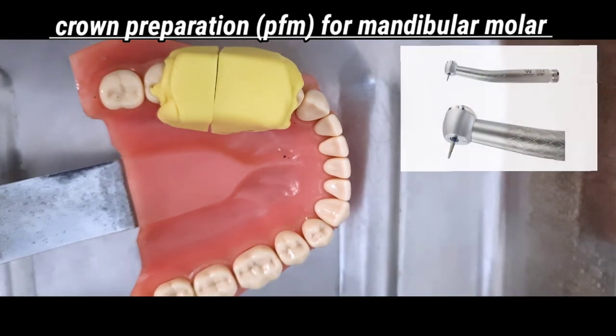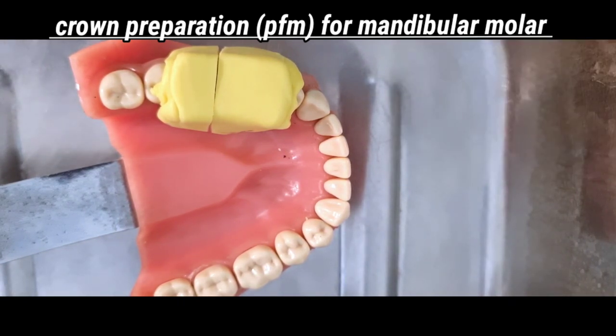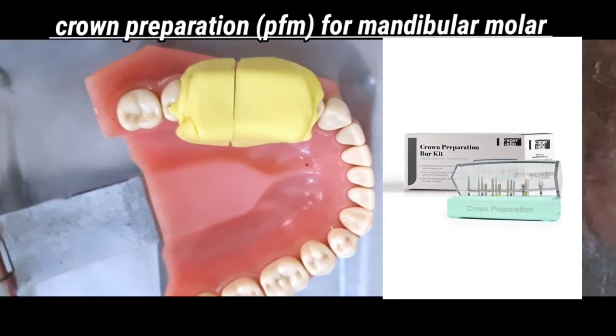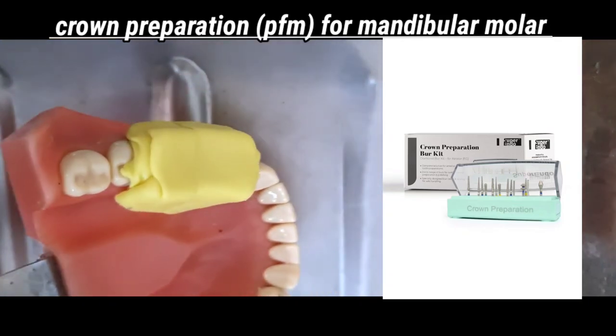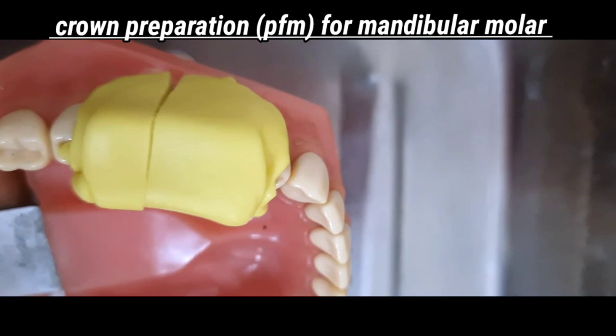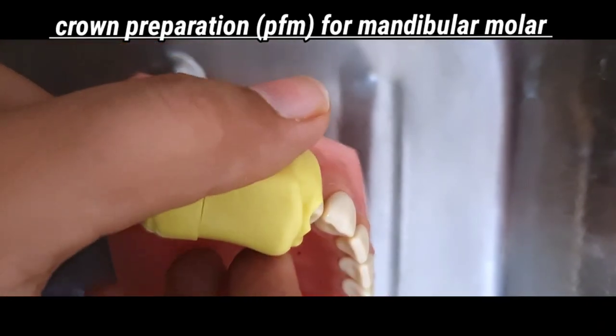Hello guys, welcome back, and in this video we are going to demonstrate tooth preparation or crown preparation on the mandibular molar for a PFM crown. To make a crown preparation, we use a handpiece which is used to rotate the diamond burrs that are useful for crown preparation. Likewise, we have kits available for these diamond burrs that are useful for preparing the tooth.